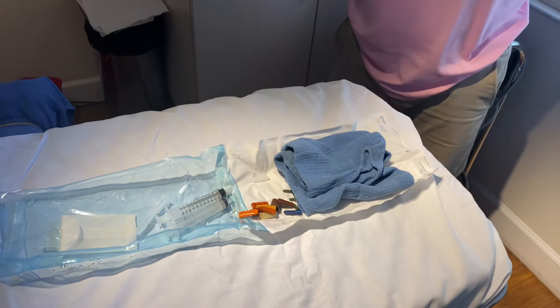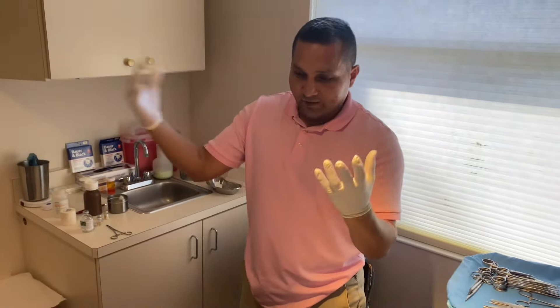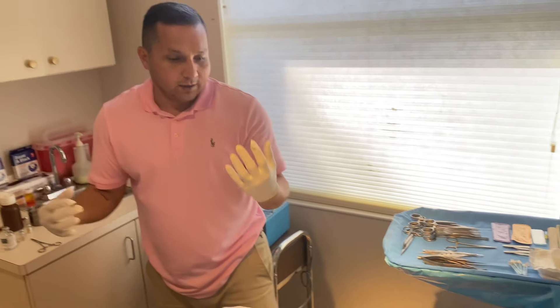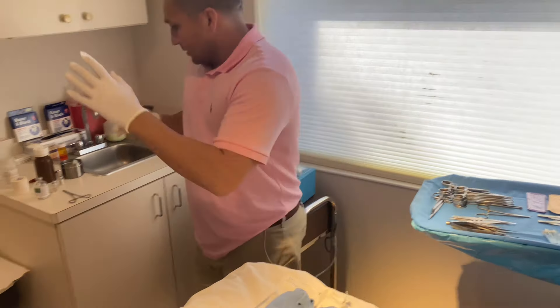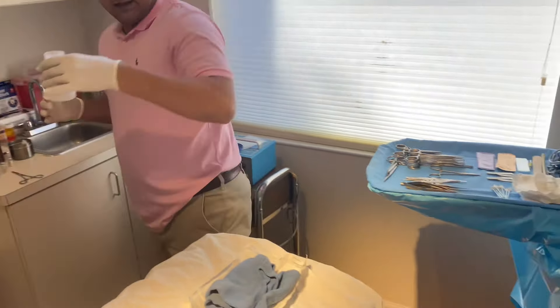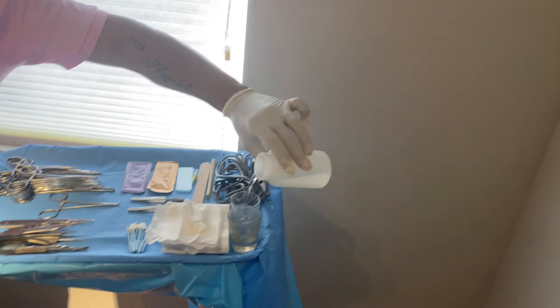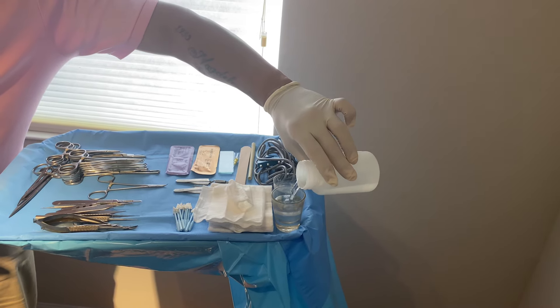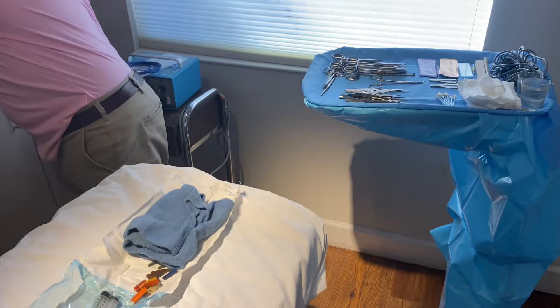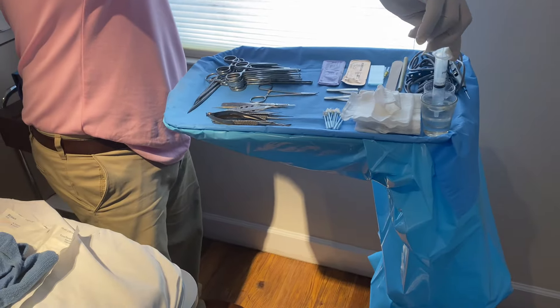This is where I break contamination on my left hand. My dominant right hand stays sterile. If you're left-handed, you'll contaminate the right hand instead. So with my left hand — which is now contaminated — I come over here and grab the saline water and fill the cup about halfway. Then with my dominant right hand I'll grab the slip tip, keeping my contaminated left hand away, and fill it up.